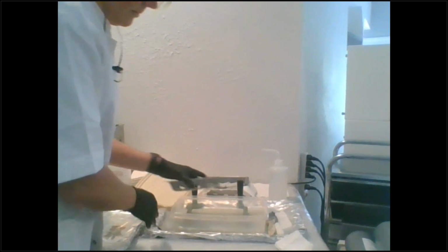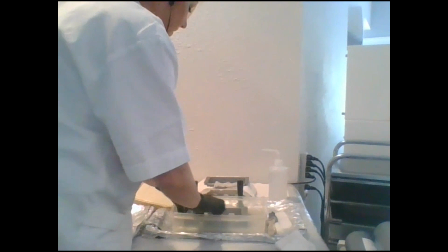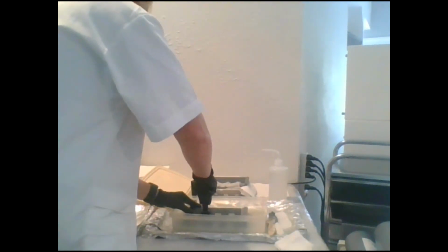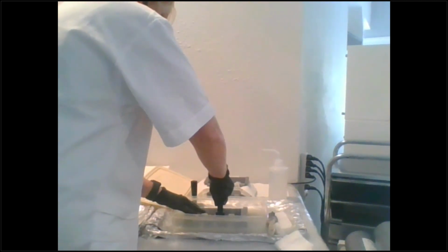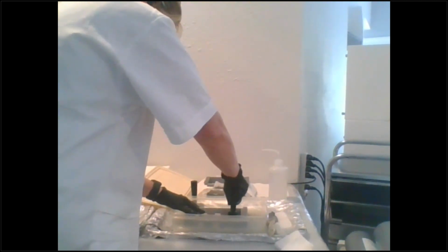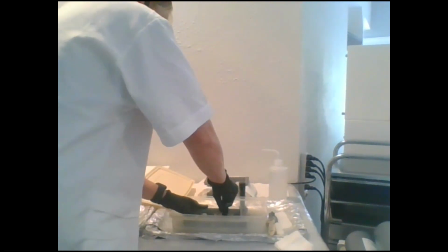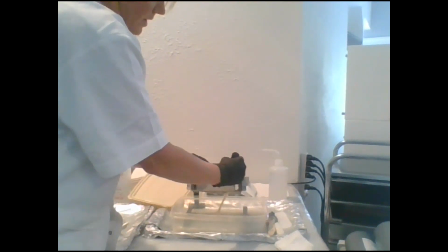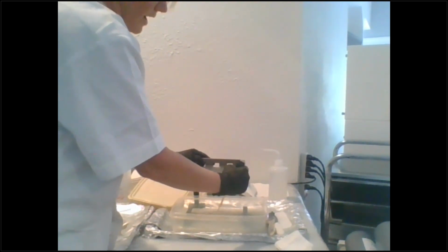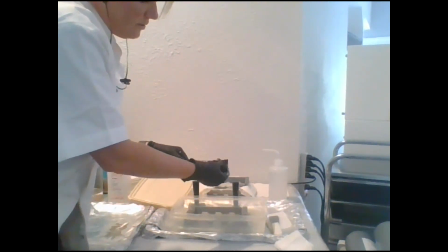And what I'm going to do is I put all my really dirty IPA in here, so it's always on rotation. And then I use my punch tool, and you're going to go along to the right and then back through the middle. And by the way, we're working on some new prototypes for this, so this way you don't have to. And so I'm using this bigger one, and this one actually is just 4 times. So instead of having to go all the way through. But what you have right now is this one, and you're going to go punch, punch back, and then punch to the right again.